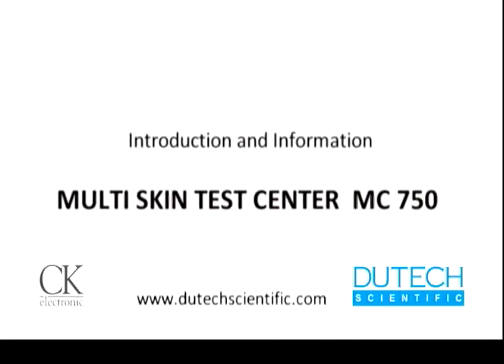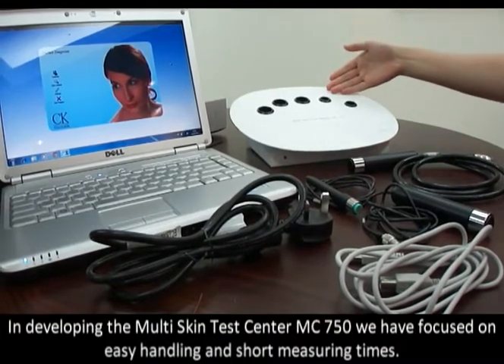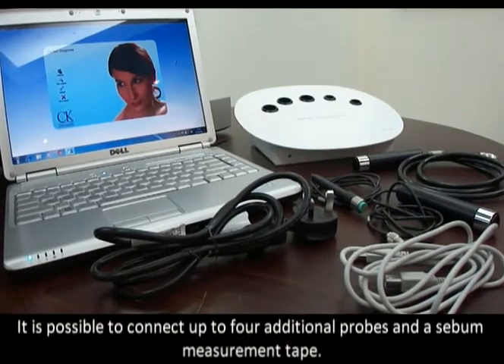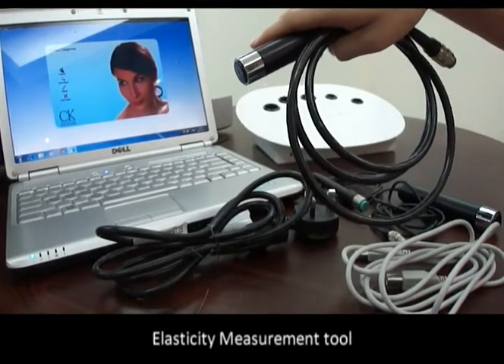Introduction and information of the Multi Skin Test Center MC750. In developing the MC750, we have focused on easy handling and short measuring times. It is possible to connect up to four additional probes and a sebum measurement tape. The device also includes an elasticity measurement tool.